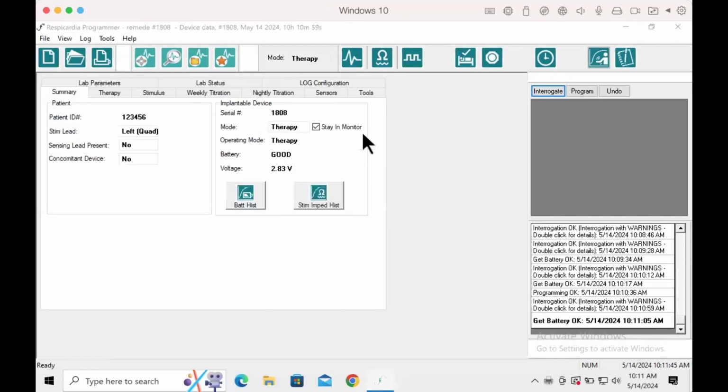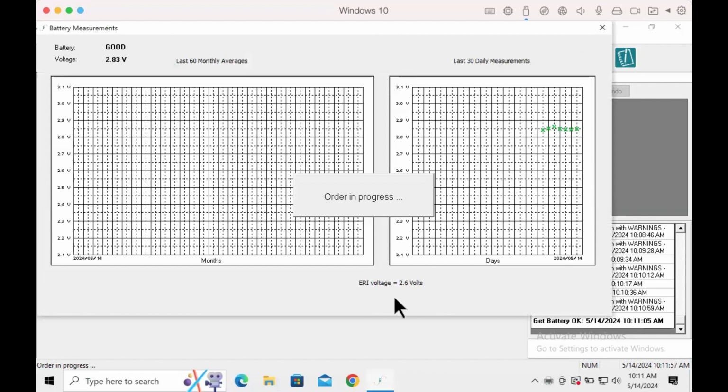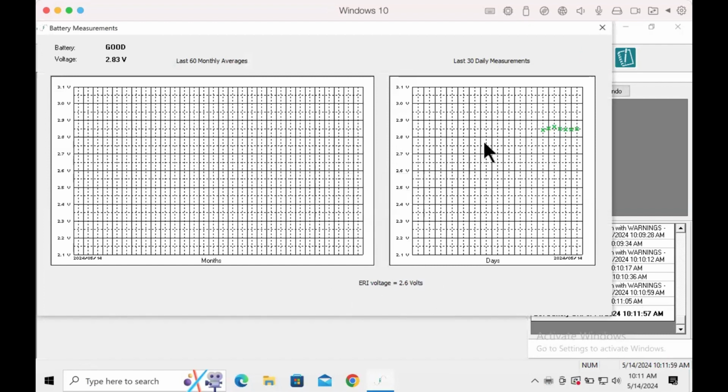A battery status of ERI, elective replacement indicator, is a battery voltage less than 2.6 volts. And a battery status of EOL, end of life indicator, is a battery voltage less than 2.5 volts.